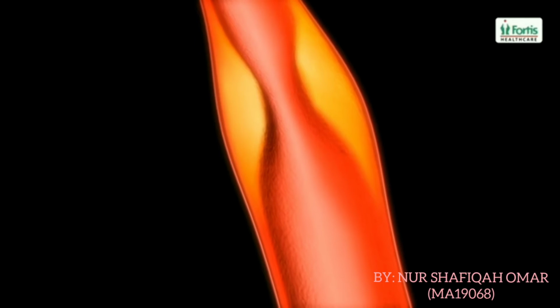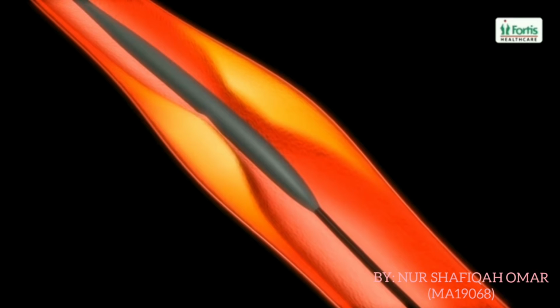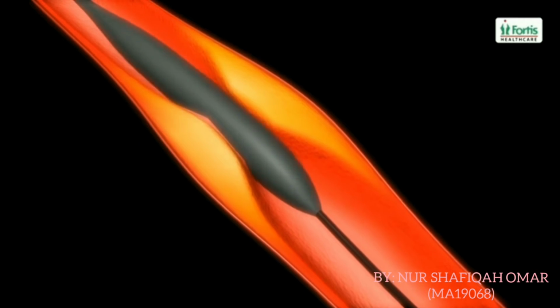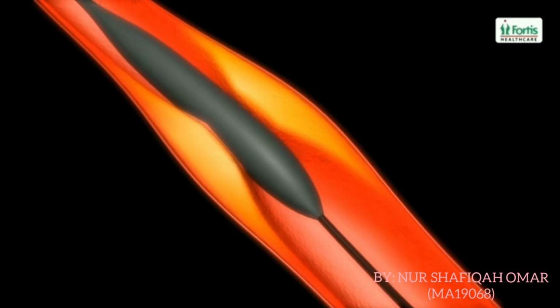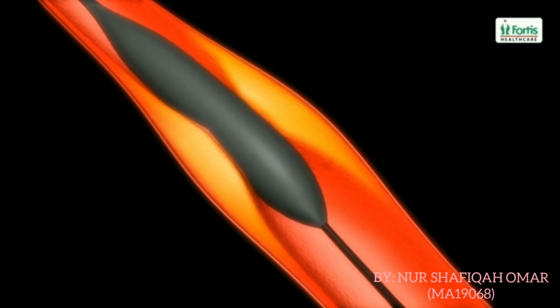For the procedure, first, when the blockage is identified, the doctor will put a long, thin and flexible tube called a catheter and slide it over the guide wire to the heart. A tube with a small deflated balloon inside it will be slid through the catheter and into the coronary artery where the blockage occurs. When the tube reaches the blockage, the balloon will be inflated.